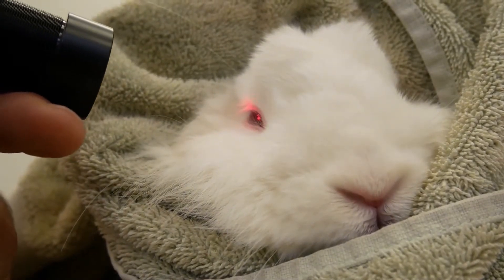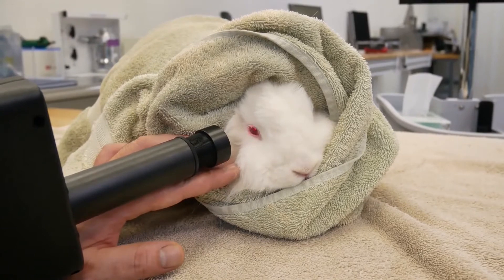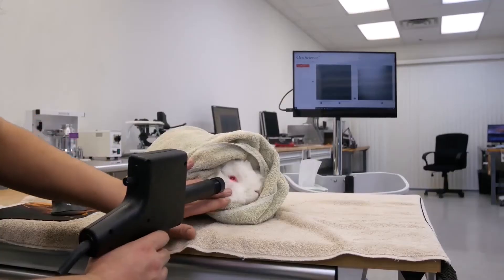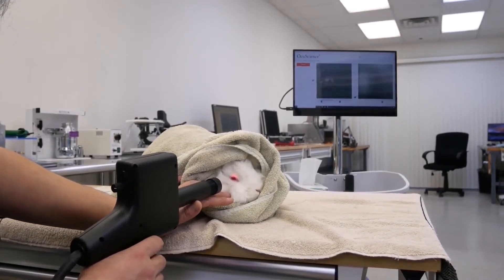This is Lily, and today she agreed to let us take a look in her eye. Lily will not be sedated; however, we have added a drop of tropicamide to dilate her pupil. The working distance of this optic is approximately 5 centimeters.